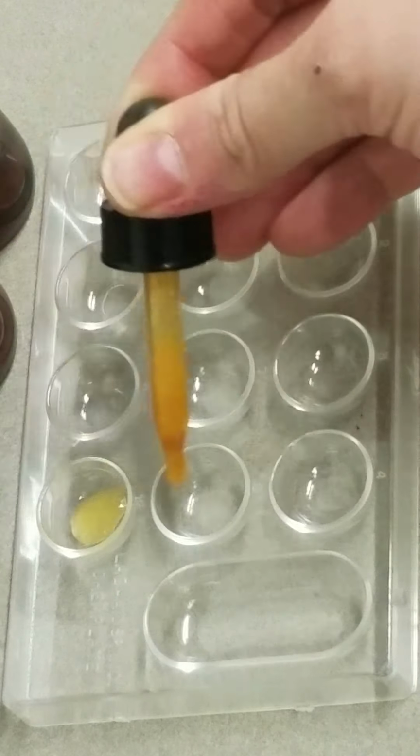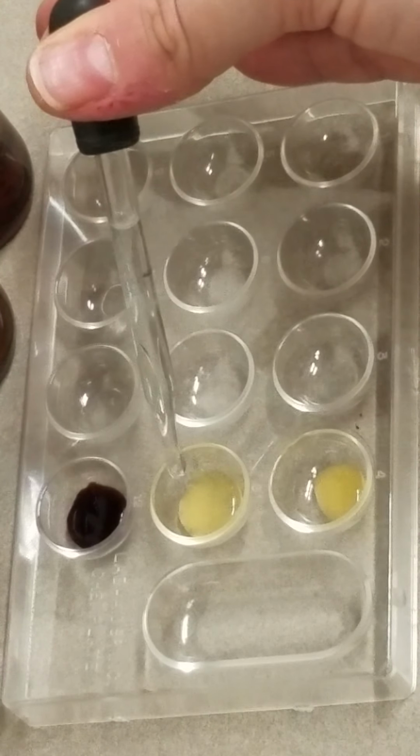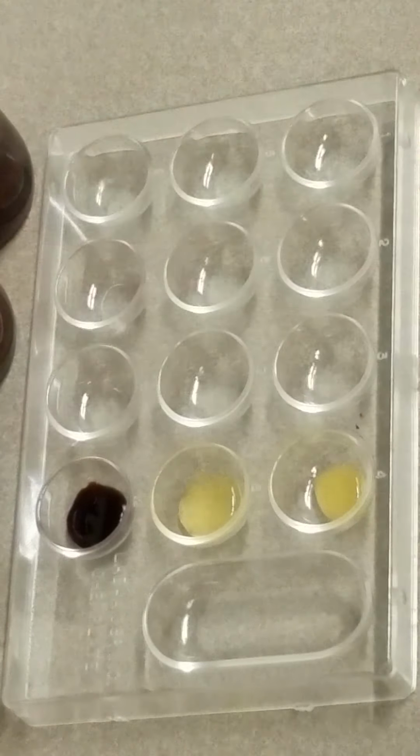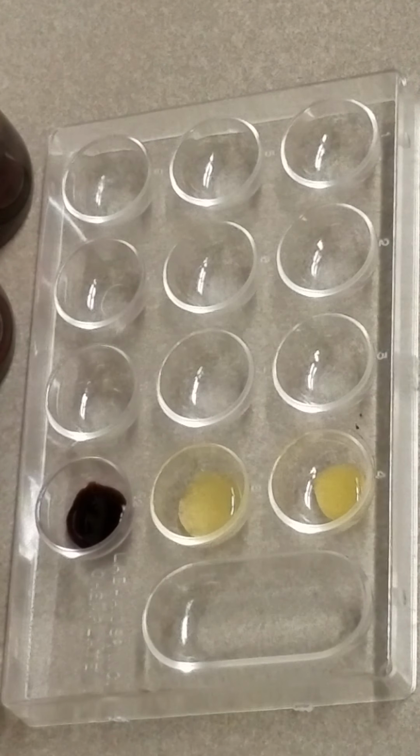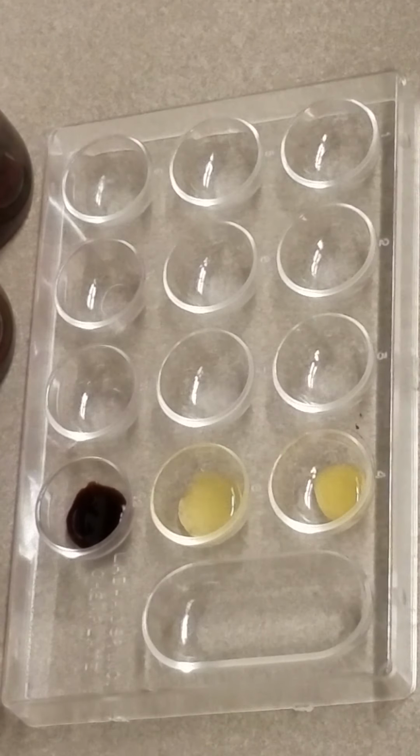Okay, now I add a few drops of B, and it gets a little thinner, but there's not a reaction. There's not a color change. There's not a clumping or any type of precipitate or a solid that forms. So I would say that that's not a change.